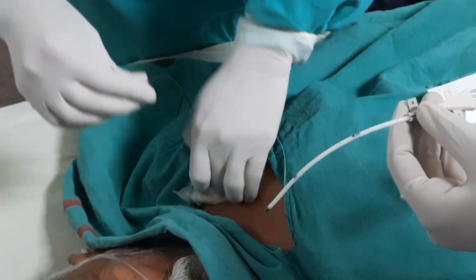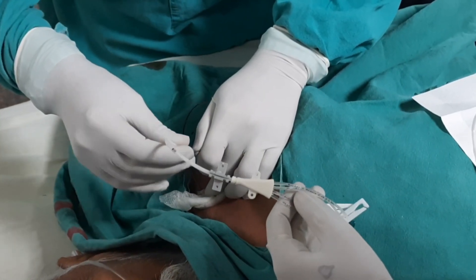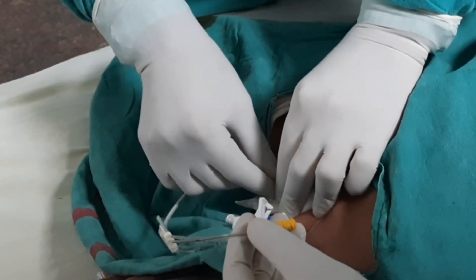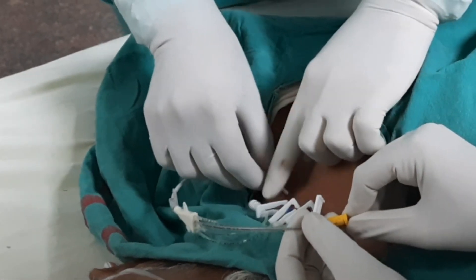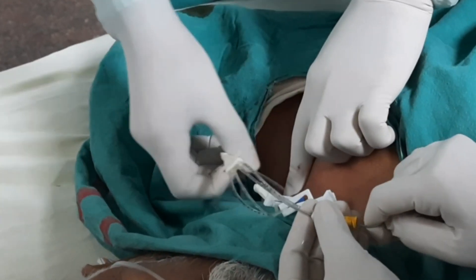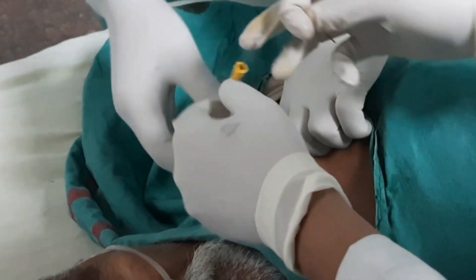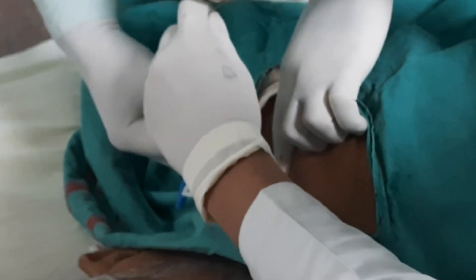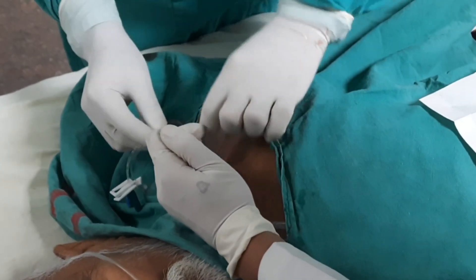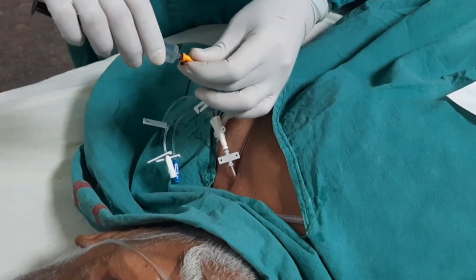After that, we will insert the central line over the guide wire. Once we go near the entry site, we will remove the guide wire until it comes out of the yellow port, because the yellow port is the distal end. Once it comes out, we insert the central line inside. After insertion, we remove the guide wire completely, then lock the central line so blood does not come out.